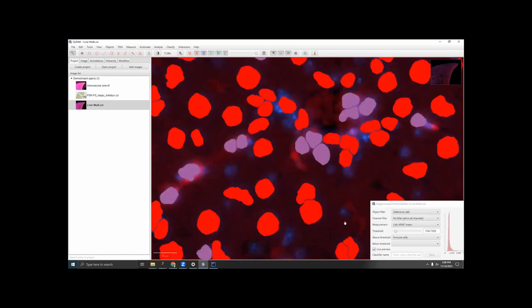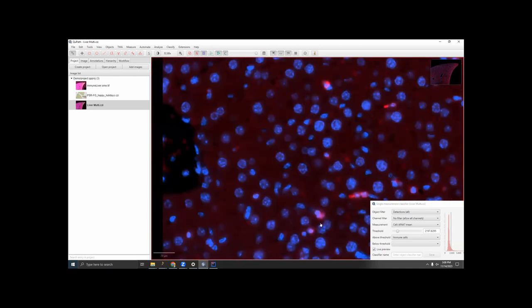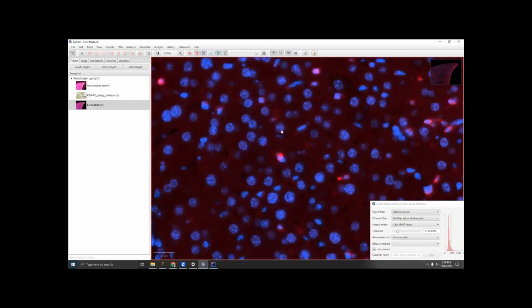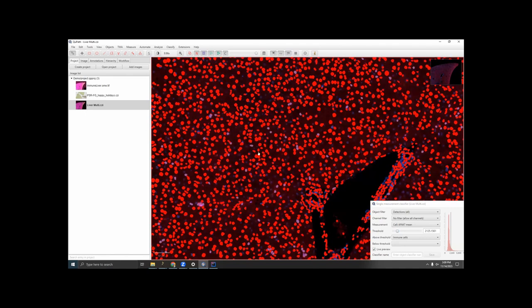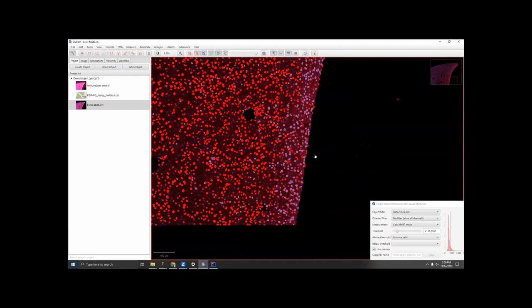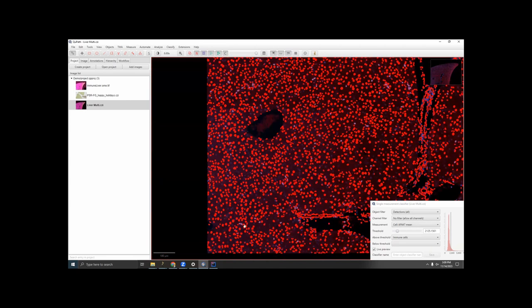So we can set a threshold that looks pretty good in this region. And I'd say overall, that looks pretty reasonable, at least as good as my segmentation is, which is by no means perfect. But if we move to the other side of the tissue, the entire right side, all of the cells along the entire right side are positive. And if we were to try to raise the threshold so that we didn't get these cells, we would lose all of the positive cells over on the left.